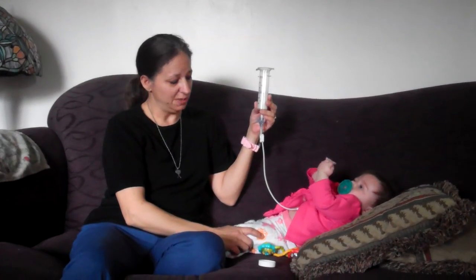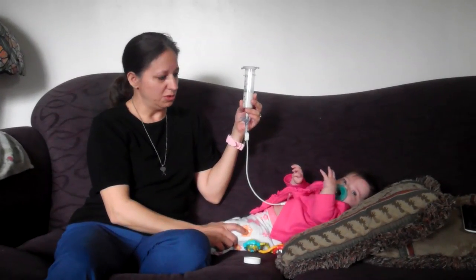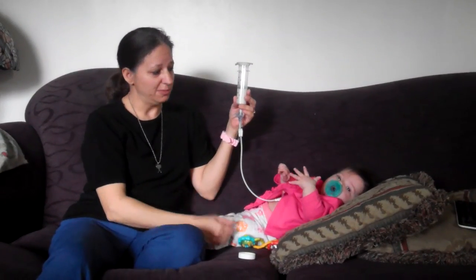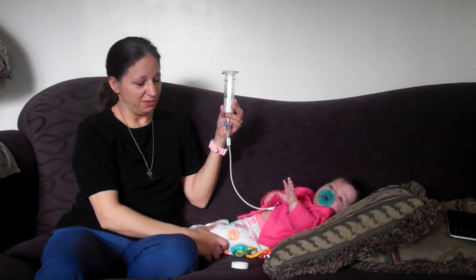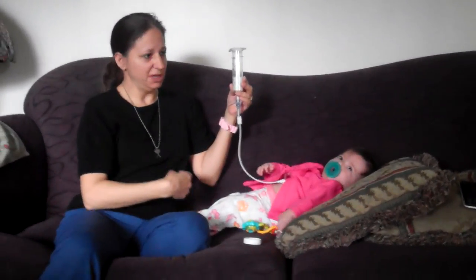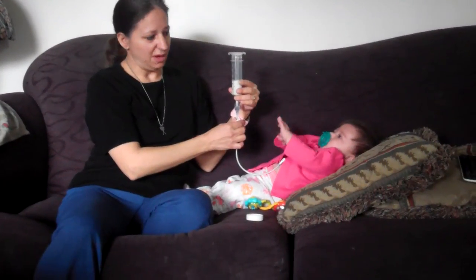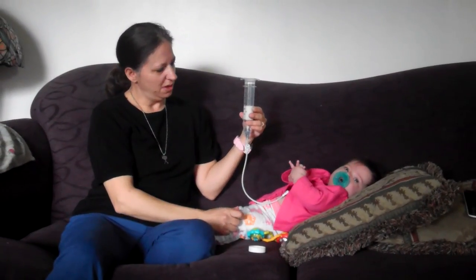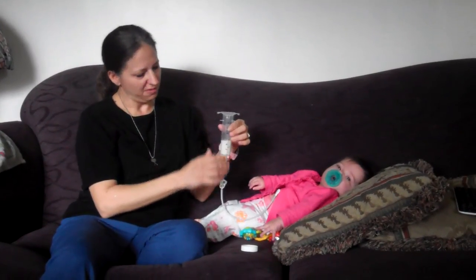And with Hannah, she also had a fundoplication surgery because she has severe acid reflux, which means it would come up out her nose, out her mouth, and it just wasn't good for her. It wasn't a good experience with her eating. So what they did is they separated the stomach from the wall, and they loosely wrapped it around the bottom of her esophagus, so when she eats, it'll get bigger, it'll inflate, and kind of stop it from going up her esophagus. See, now to me this is going a little bit fast, I think, so I can lower it a little bit, see how that goes.